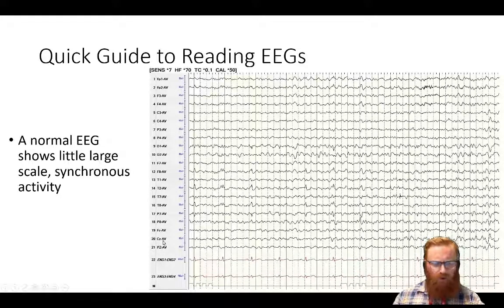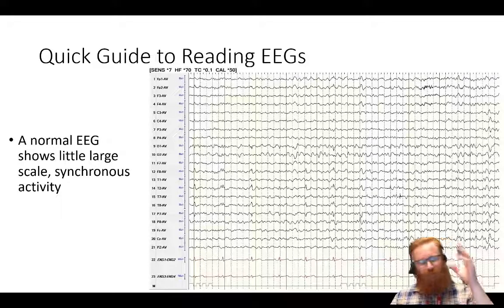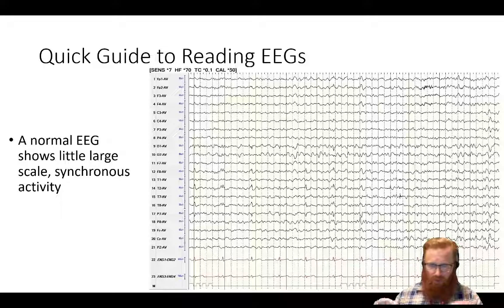And this is because we do this something minus something else because there's a lot of electrical noise in the world coming out from computers and phones and radio towers and the power lines, but we assume that on the level of somebody's skull all of those noises will be identical. So when you do one signal minus the other, you remove that common signal and are left with only the biological signal.